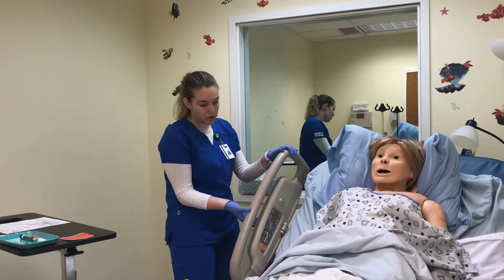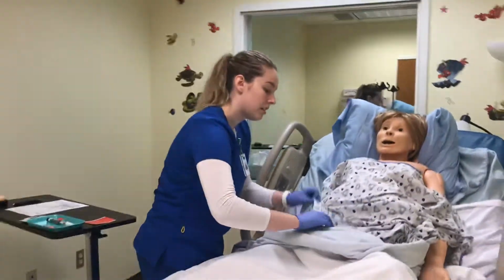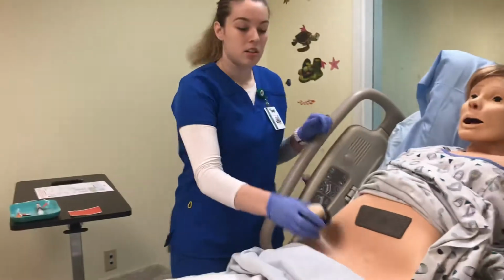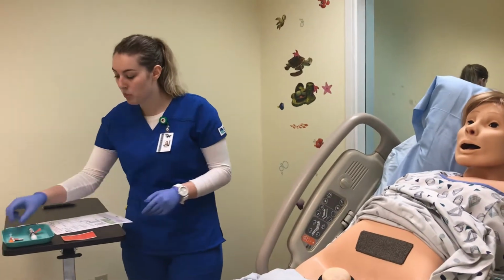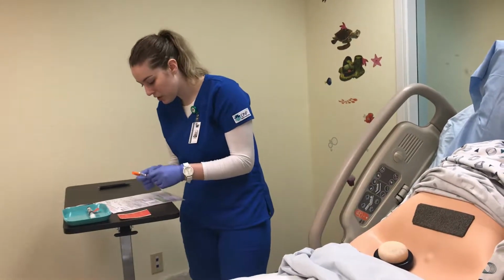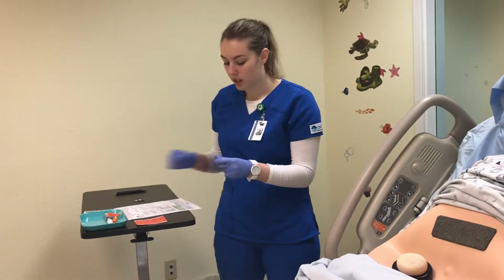So I'm just going to raise your bed to an appropriate height for me. Okay, so I'm just going to expose your abdomen, Shirley. Okay, so Shirley, first we have for you your NPH insulin and your regular insulin, which can be mixed in a needle. So I only have to give you 1 injection for that today. So I have your NPH and your regular, 15 units and 10 units, which makes 25 units in total, which is what I have. So Shirley, I'm just going to wipe off your abdomen really quickly.